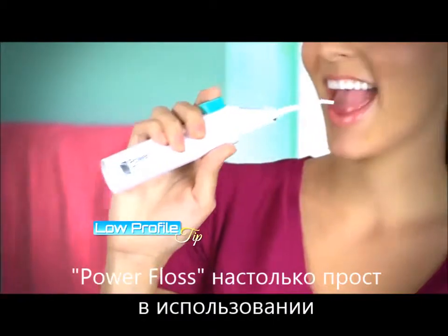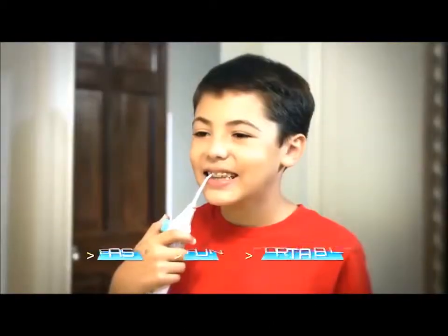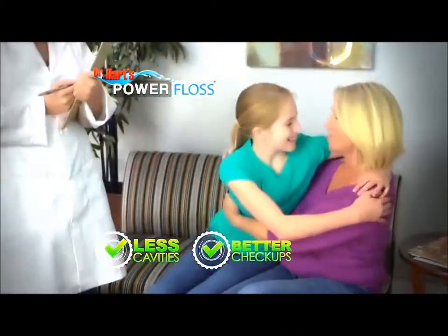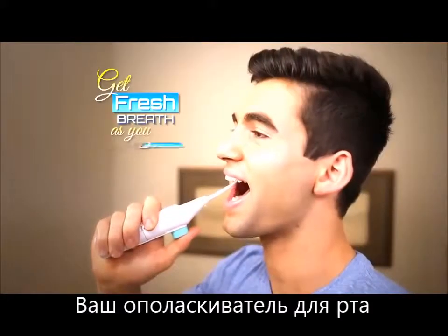And with its low-profile tip and ergonomic design, your back teeth are easy to reach. Little ones love Power Floss because it's so easy and fun to use, and that means fewer cavities and better checkups. You can even fill Power Floss with your favorite mouthwash to get fresh breath as you floss.